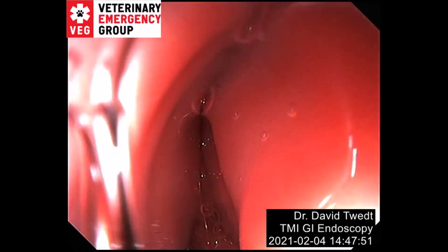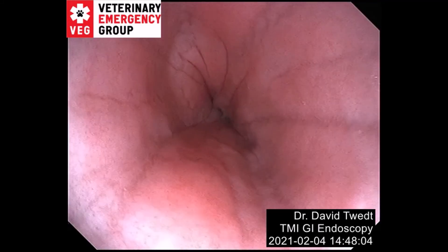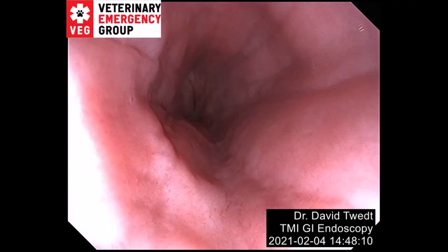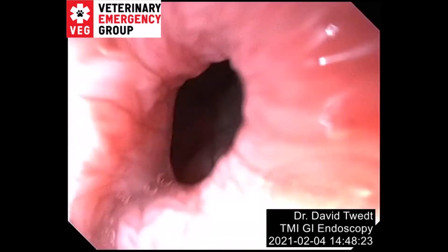And remember, as you're exiting, I've suctioned until all those folds and tissues were right around the scope. Even if I'm an intern or emergency doc looking for a foreign body, on the way out is often where I'll take a little time to examine the esophagus — make sure there's been no regurgitation, no material that needs suctioning. We sometimes will put a little tube into the dog's esophagus, flush some fluid in, and then suction it out to clean up so they don't end up with a stricture or esophagitis. So we get a nice good look, and I'm demanding that I keep it in the middle of my picture.